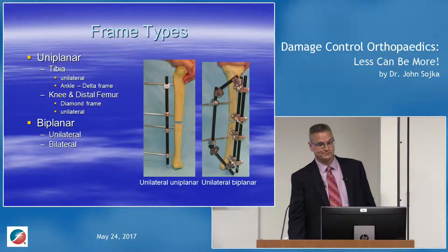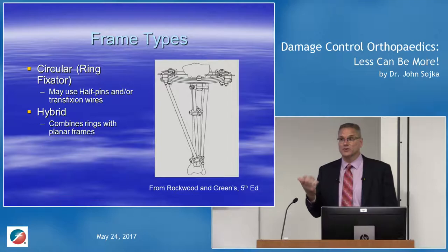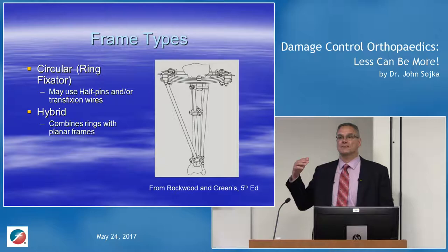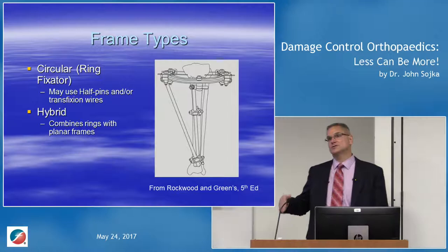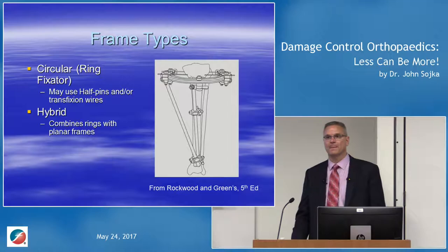There's other things like circular frames that we use, as well as hybrid frames. And again, unless you've got a lot of experience putting these on, they can be somewhat intimidating at first, or frankly, frustrating to put on because we have a lot of reps that come in and will participate in the case with us to help us when we have small segments or segments that are very near joints. So those are things that complicate it, and so we have to have the ability to react to the situation as it arises. And circular frames or hybrid frames, where you're using a combination of a fine wire frame and a heavy pin frame, help conquer those problems.